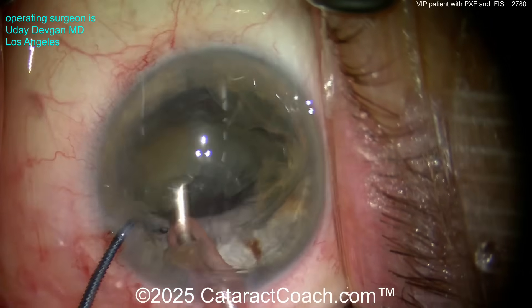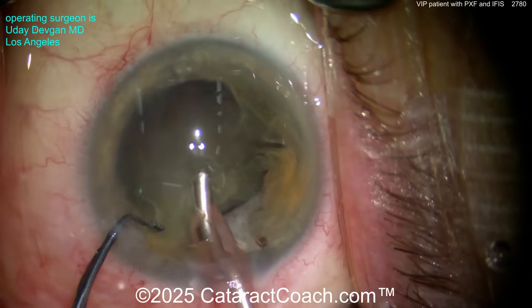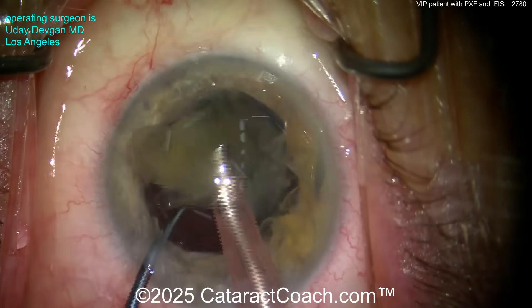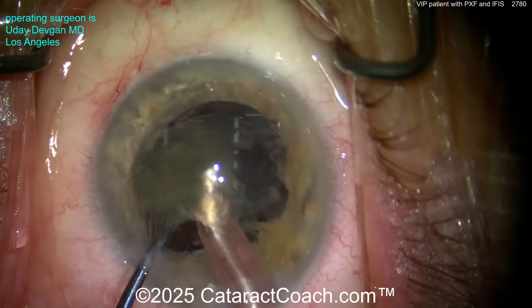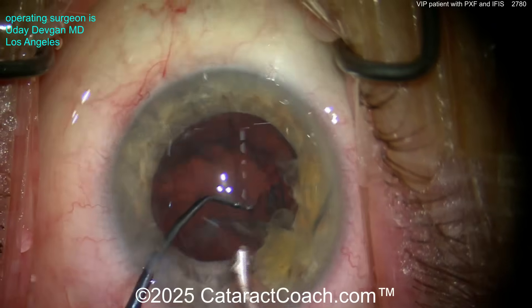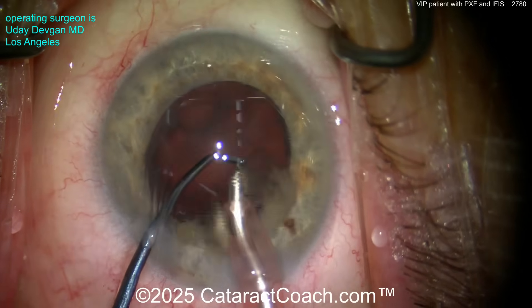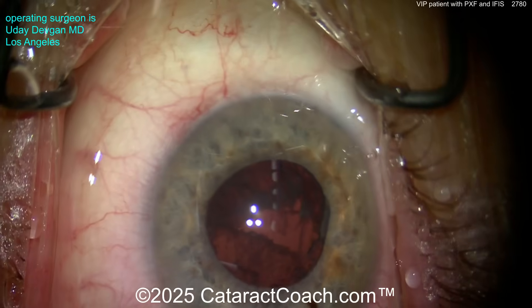This is a very VIP patient and I do not want to put in a capsule expansion ring, pupil expansion ring, or iris hooks. The reason is those devices do damage the iris — let's be honest. If you look at an eye at the slit lamp a year after cataract surgery, you can tell they had iris hooks or a pupil expansion ring — a Malyugin ring or whatever — you can tell. I don't want that. The nucleus is already gone — look at that. I kept the chopper in that safe position because I don't want that posterior capsule coming up no matter what. Beautiful — got that nucleus out pretty easily.